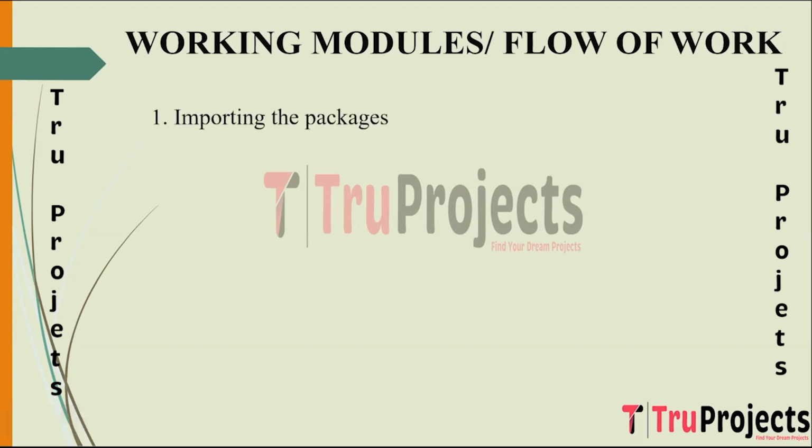This stage involves importing essential libraries and frameworks like TensorFlow, Keras, NumPy, Pandas, and Matplotlib. TensorFlow and Keras are commonly used for building neural network models, while NumPy and Pandas aid in data manipulation and handling. Matplotlib is frequently used for data visualization, allowing exploration and visualization of images and model performance.